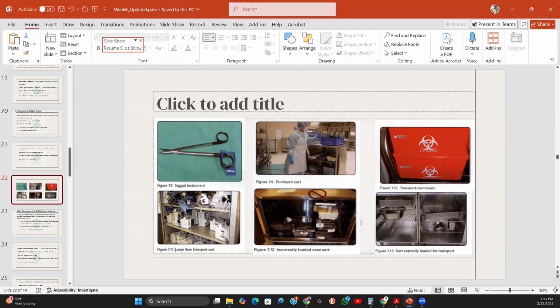You see the scissors is tagged. The blue in my facility is most of the time the turnover. It means that piece needs to be quickly taken care of. Some have red with the word repair on it. Some have yellow with the word sharpen. So every tag will communicate something. It is not just there for fun.